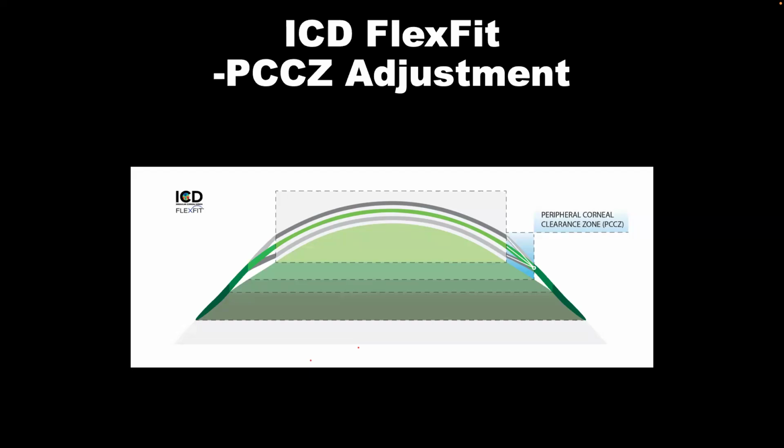This will, depending on the patient obviously, almost always be around a minute or so. So yeah, and even if you're flattening -8 steps, again, just drop down and go to the previous lens, right? This will basically be a more consistent fit than just going and altering the fit of the lens with over +8 steps or -8 steps.